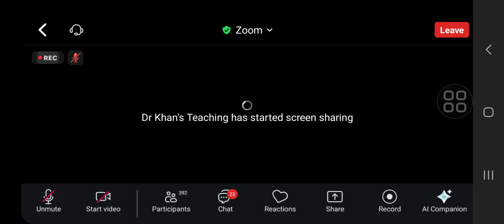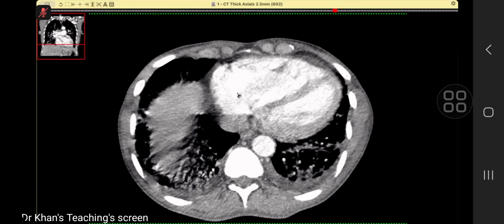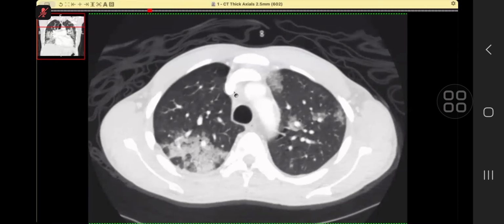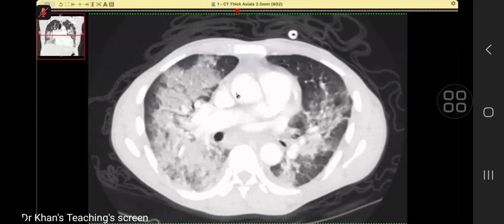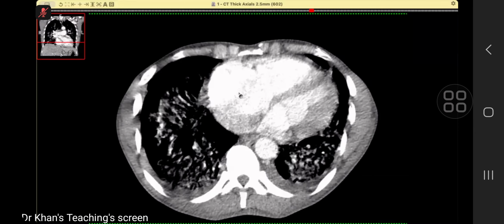Now, let's go back to the case. Till this point it is fine, because the findings were totally non-specific. Then candidate one, I had to actually nudge you to ask for other windows. And then there was a very leading question, do you want to see anything?